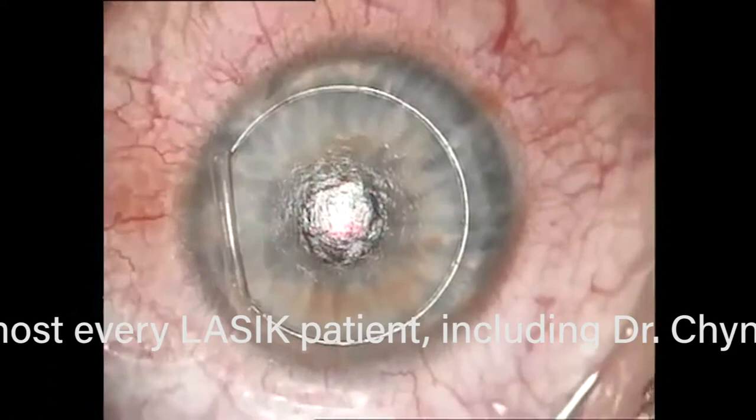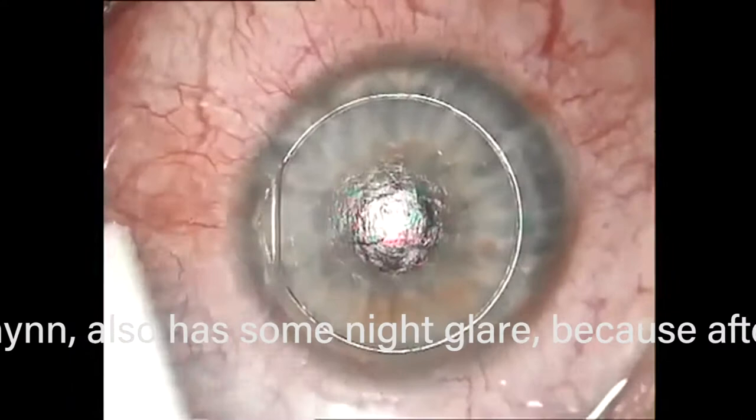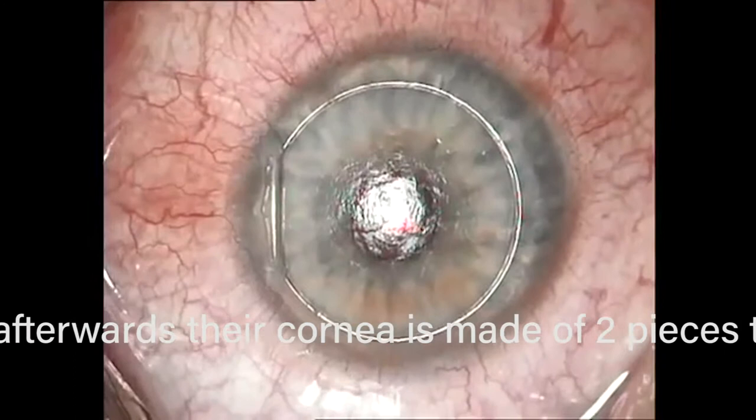The downside is you can have a bad flap. You could have flap striae — wrinkles on the flap. When you put the flap back, you're only lining it up manually — you're just eyeballing it — and it could be a little askew, which can cause induced astigmatism.